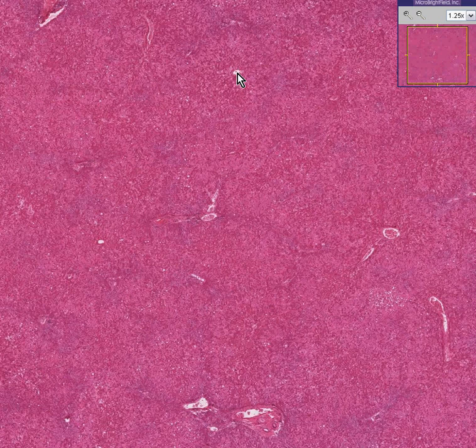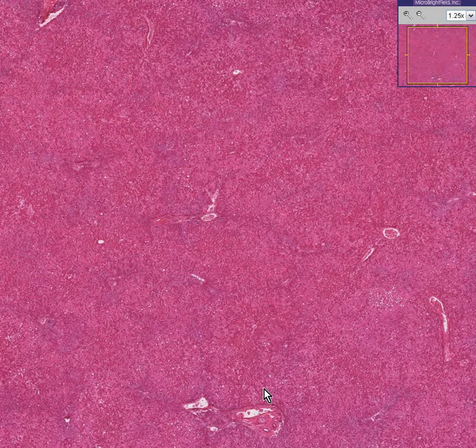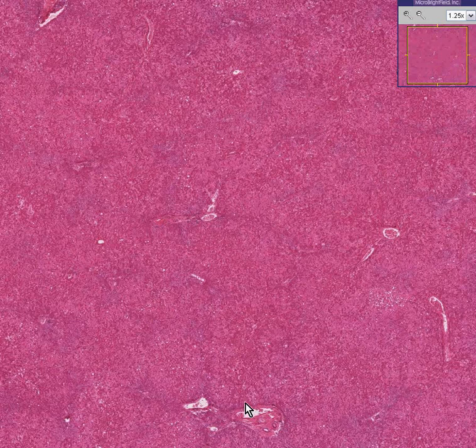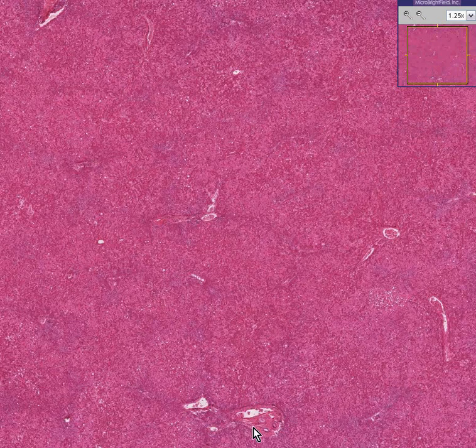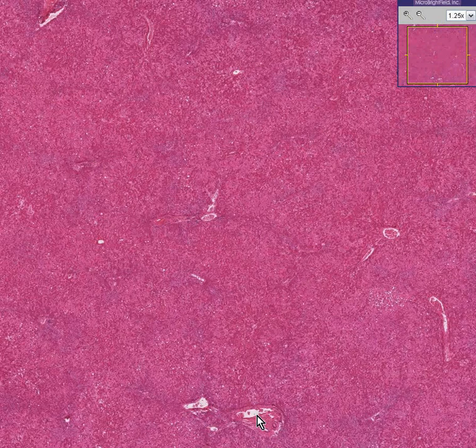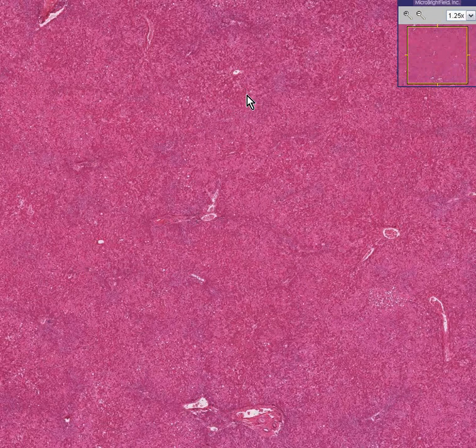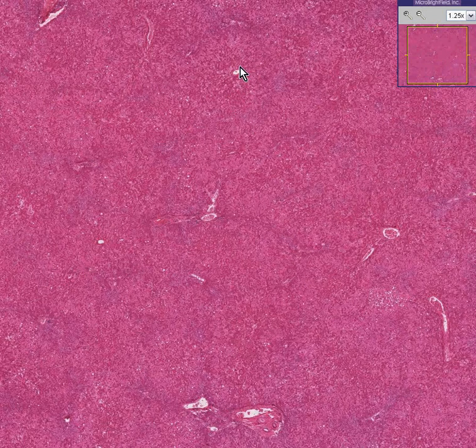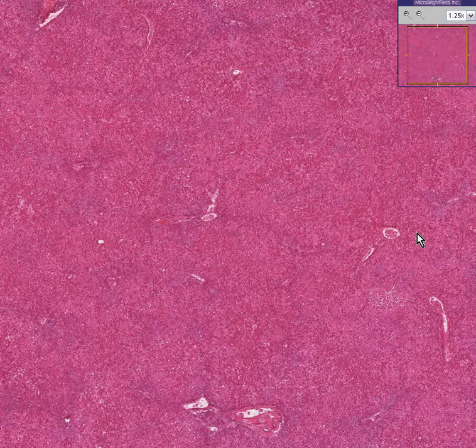On the other hand, when you see vascular spaces like here and here that are surrounded by connective tissue, you know that these are probably portal veins and a hepatic artery and a bile duct. But when you see little veins all out there by themselves, and it even looks like some of the cords may be converging on them, like here and like here, you know those are central veins.